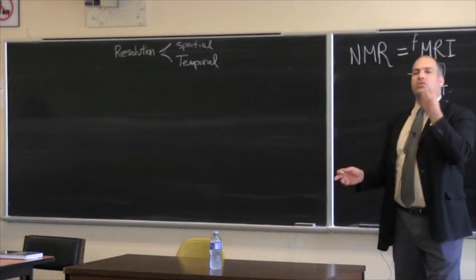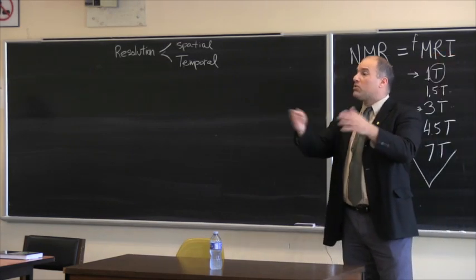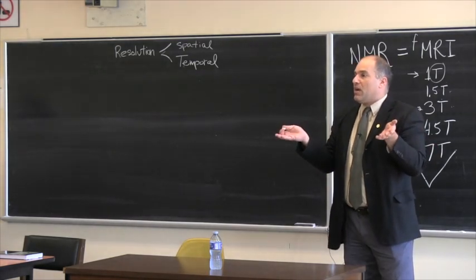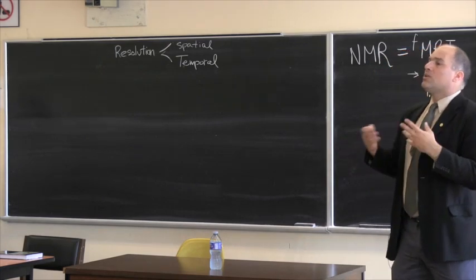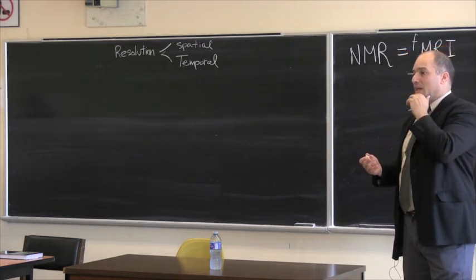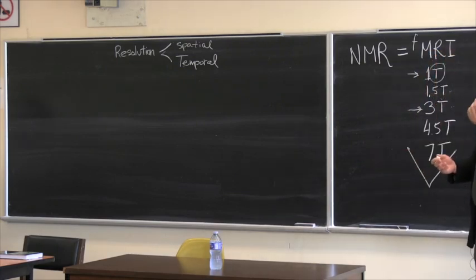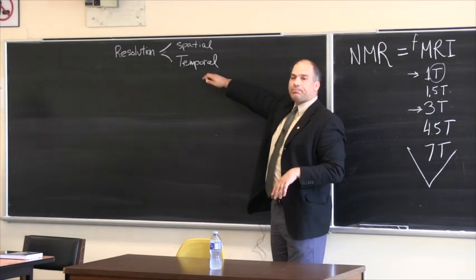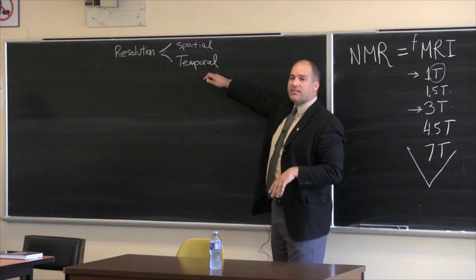I'm interested in asking certain questions which would be the kind of things that would be interesting to this group. You're not interested in pushing these technologies by coming up with patents or ideas of how to make the field higher or so on. You're interested in what kind of questions it can answer. And in order to understand what kind of questions it can answer, you also have to ask yourself, what are the limitations? So one limitation is, how fast can this go? How fast can MRI go, or fMRI? How fast can it go?